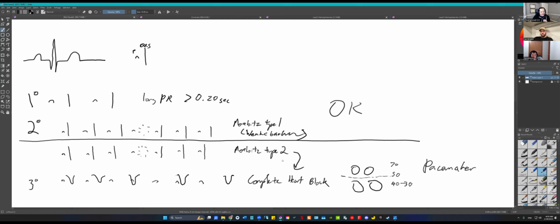It almost doesn't make sense. So this is a kind of progression then? Not quite. The Mobitz type 2 is something that's completely injured and wrong with the AV node. Mobitz type 1, the AV node is just misbehaving, but people can walk around with Mobitz type 1 for decades. Type 2 turns into kind of a time bomb where you don't know what the timing setting is, because this can flip over to complete heart block. I've seen it happen once in my shift.